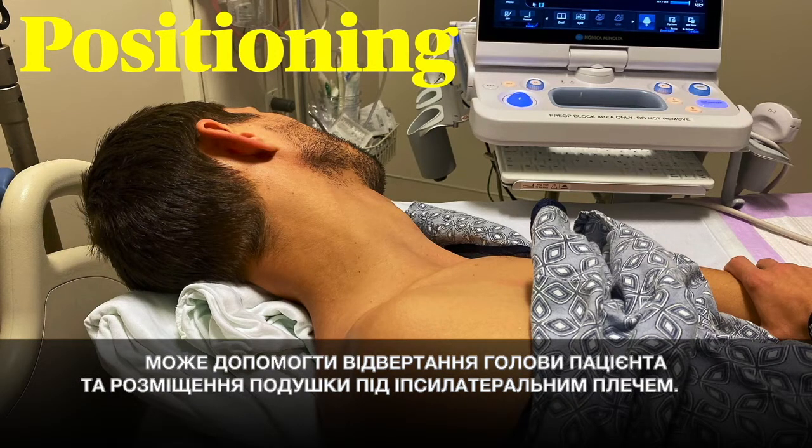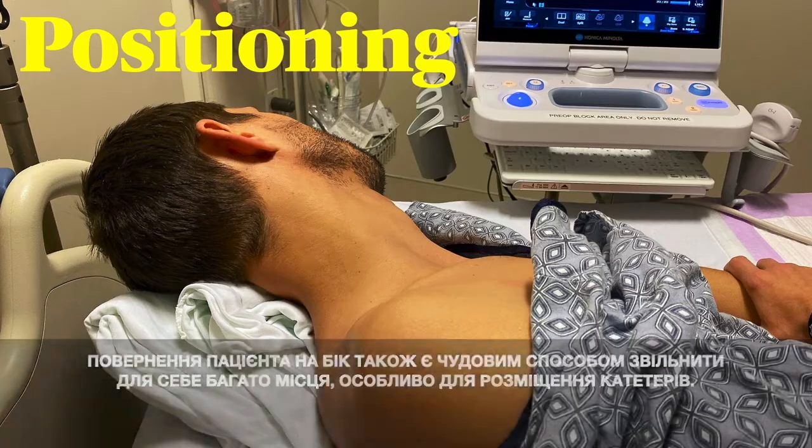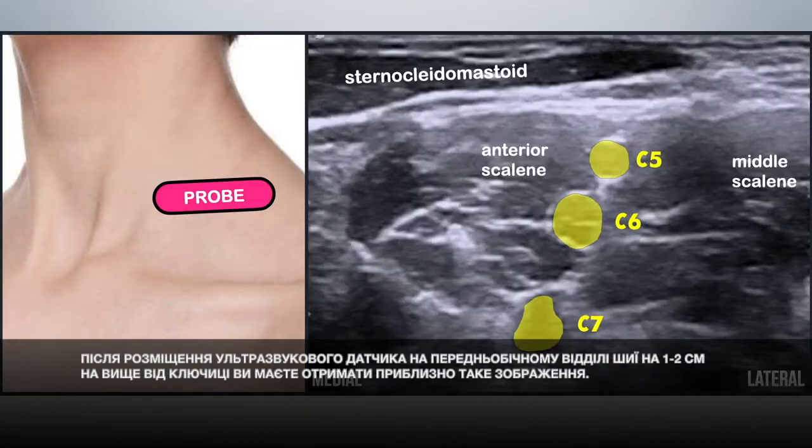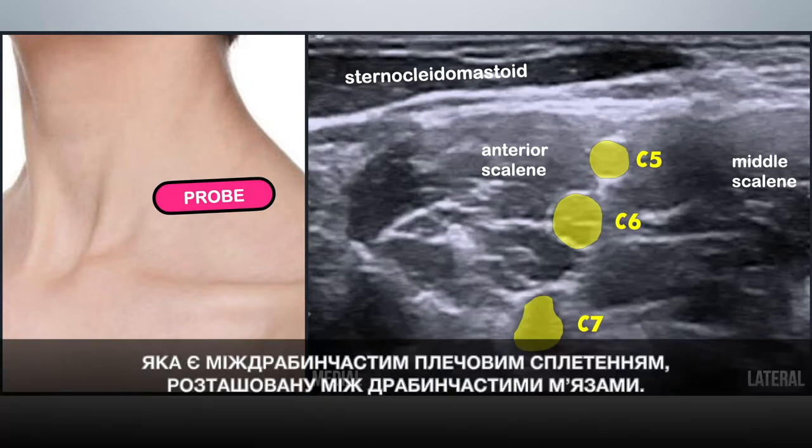For positioning, you want to have good exposure to your working area. Turning the patient's head away and placing a bump under the ipsilateral shoulder can help. Turning the patient on their side is also a great way to give yourself lots of room, especially when we're placing catheters. Placing an ultrasound transducer on the anterolateral neck 1 to 2 centimeters north of the clavicle should get you an image like this. You can see the posterior aspect of the sternocleidomastoid muscle, the anterior and middle scalene muscles, and the string of black pearls that is the interscalene brachial plexus nestled between the scalenes.